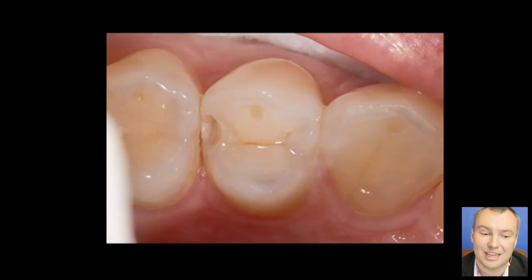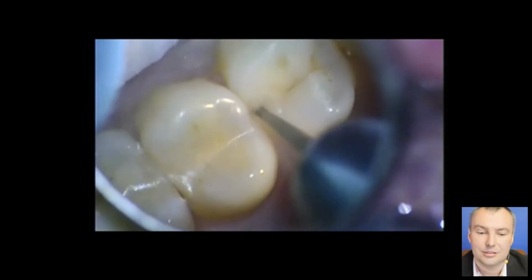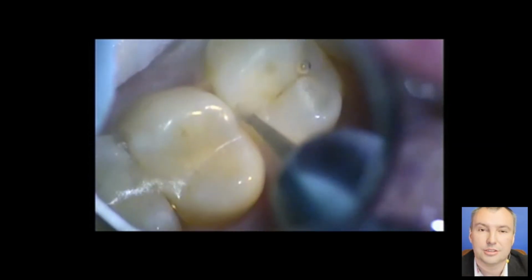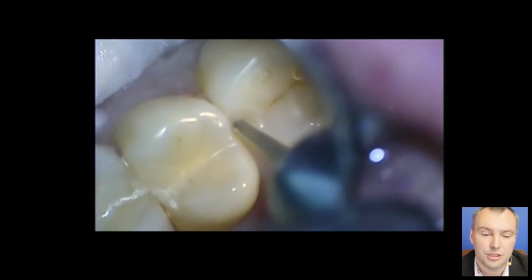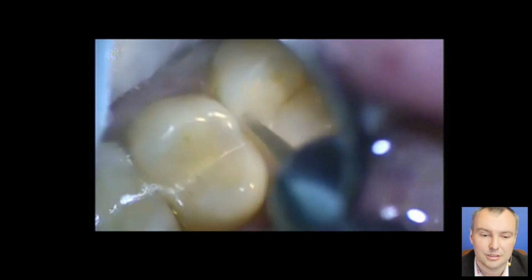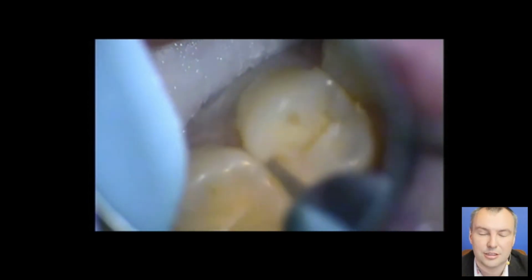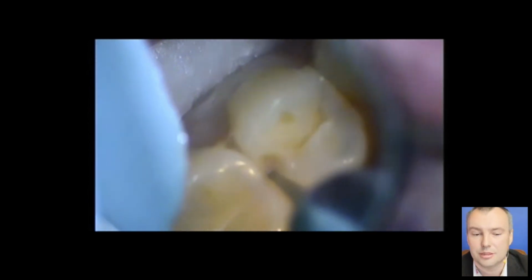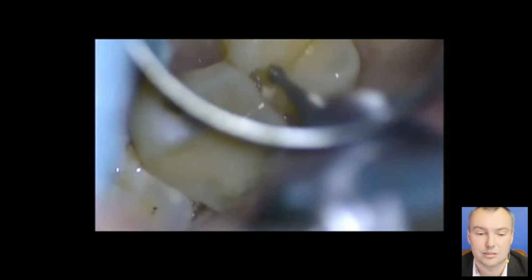So this is how it looks, just the demineralization. Then we drilled a bit more, and in a moment we get just to the caries. And look, this is actual, real, quite deep caries. It's a premolar tooth, so such caries already is problematic for possible proximity to the pulp, because premolars are very narrow teeth. So we open it, we drill it more and more as we need to.